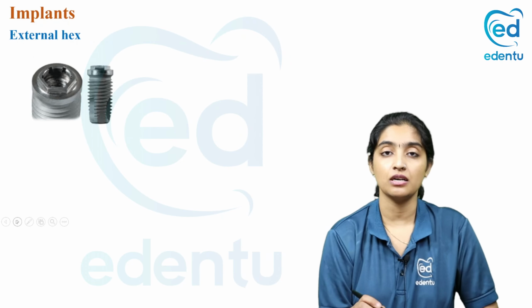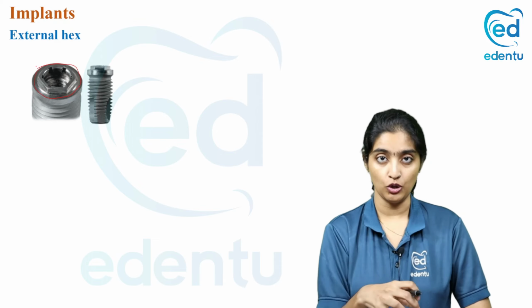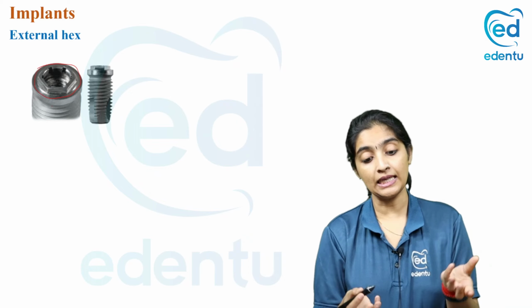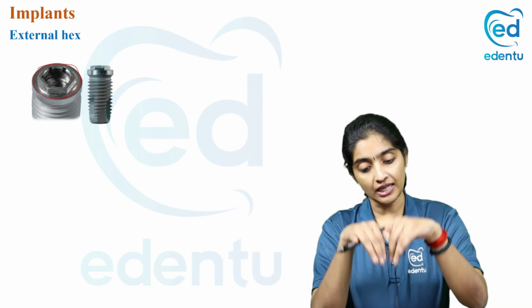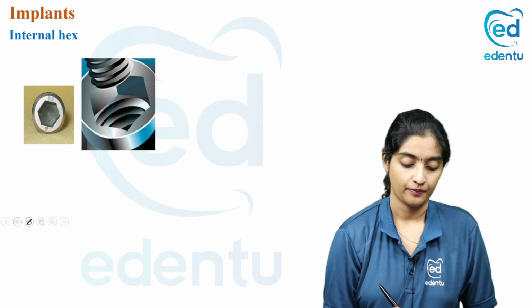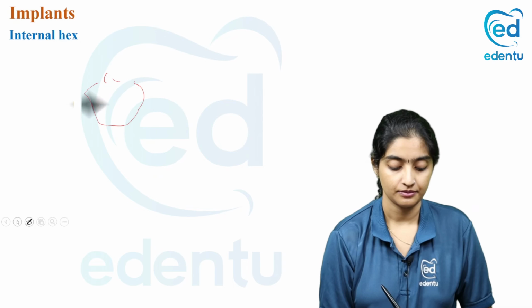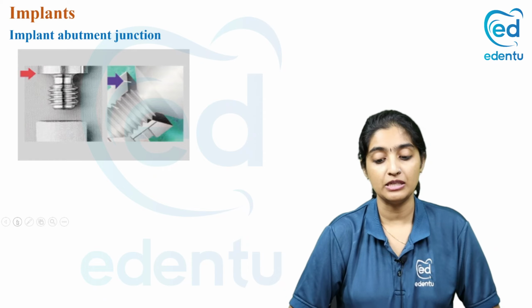This is how an external hex looks. You have the implant platform which is below and the hex is above. So the attachment is above. In an internal hex, it's straight opposite. You do not have an elevation, you have rather a depression. So it is placed and screwed within. This is how an internal hex looks. See, this is a depression and the screw goes right inside there. So this is the implant abutment junction.